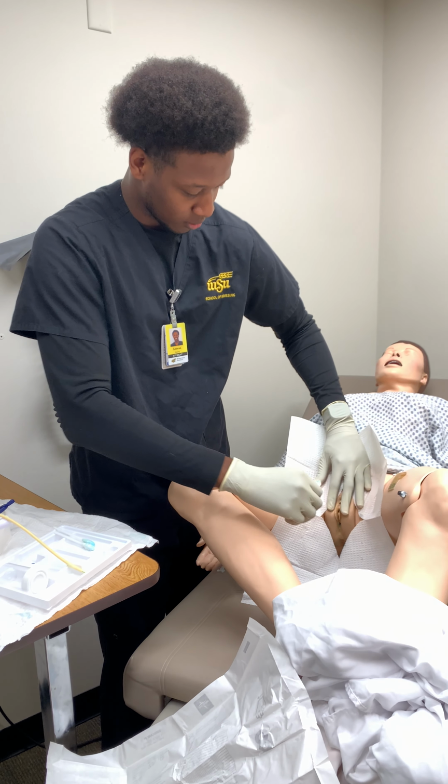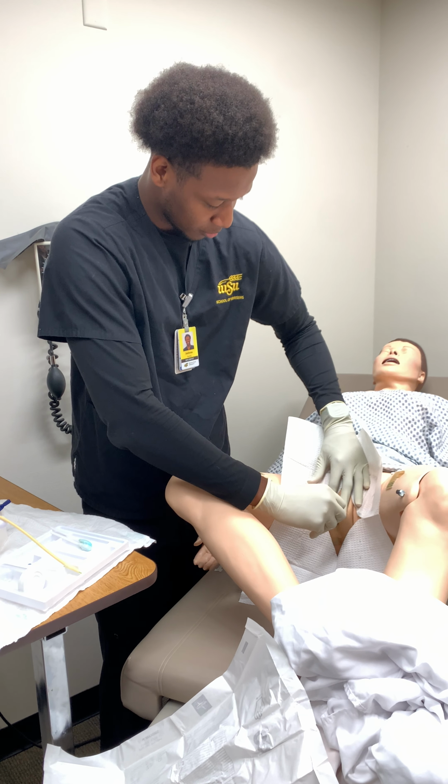Start with the labia that's away from us. Then discard that. Start with the labia closest to us. And last but not least, go down the middle. After doing that, I'll use my dominant hand to grab the Foley.